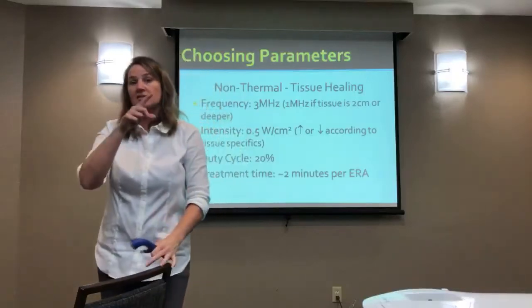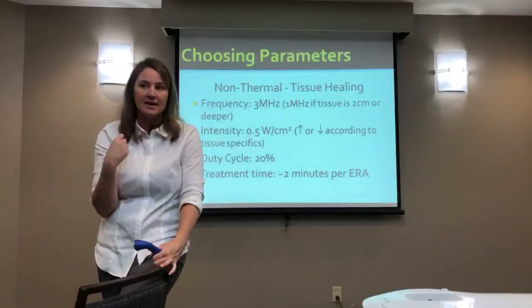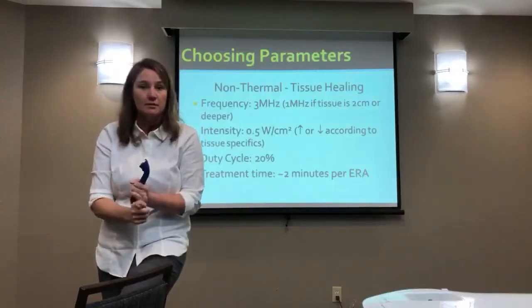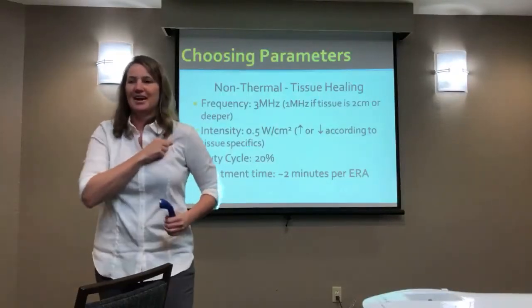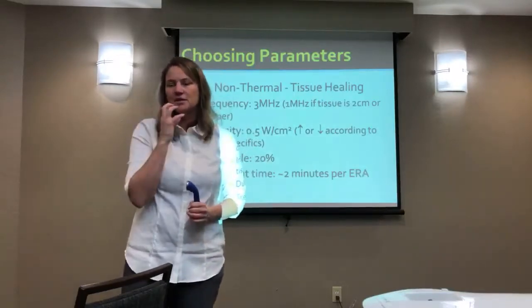See, that's where I would take you to the next level. Instead of it being a shoulder or a knee, what exactly is your target? You know what I mean? So for me, it would need to be the collateral ligament of the knee. You're gonna have to give me one, an acromioclavicular ligament or something, you know what I mean? But it would have to be... How about a strain?